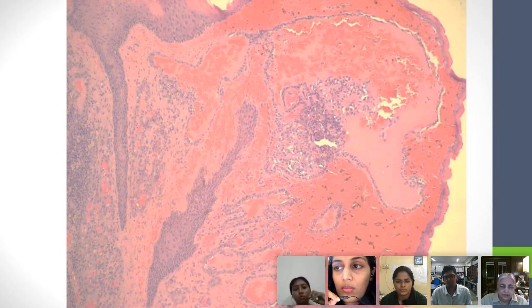When we ask what the relationship of the lesion to the normal is, is it arising from the overlying epithelium, or is it deep to it? It is deep to it. So you can say that this does not appear to be arising from the overlying epithelium. All right, and there is some sort of inflammatory process over there. Good.